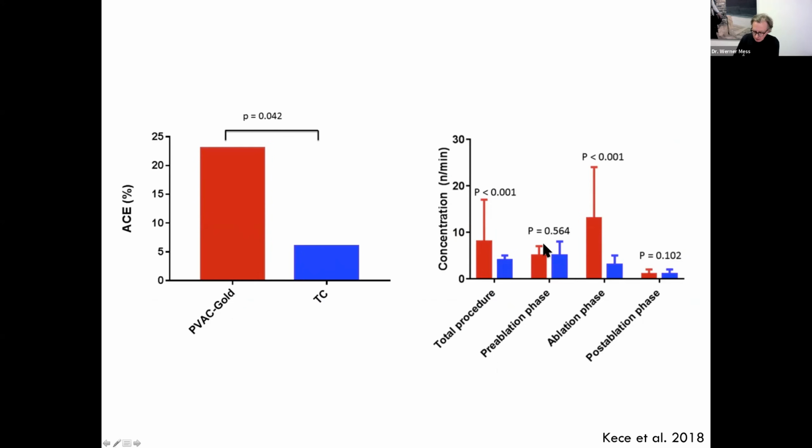So I said it in the beginning, the idea is that microemboli themselves do not cause symptoms. So if there is a single microembolus going upwards, you will not have a TIA or something. But it is an indicator that there are processes going on that might cause more or larger emboli to get released, and then you really have symptoms. So that is the idea here.